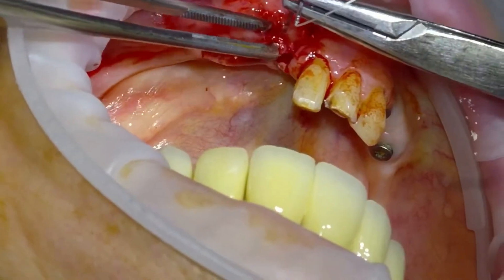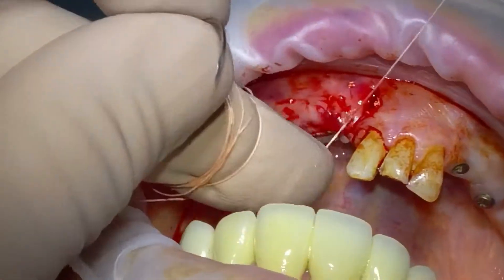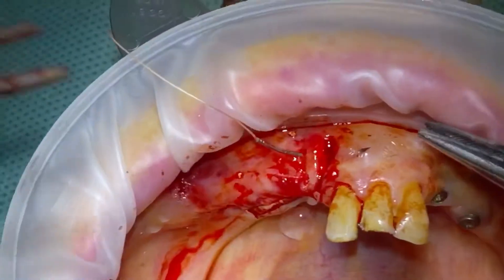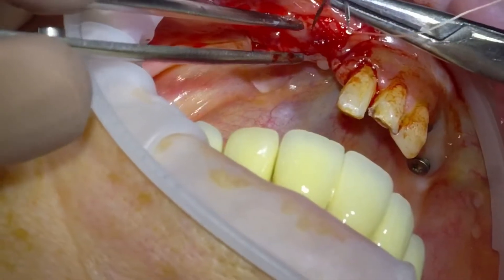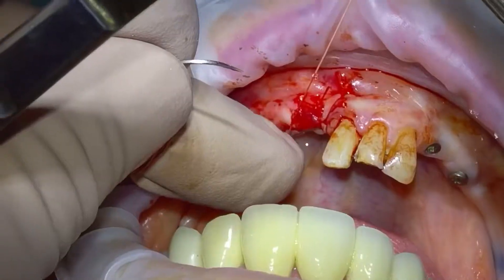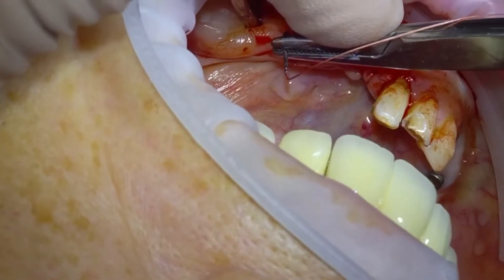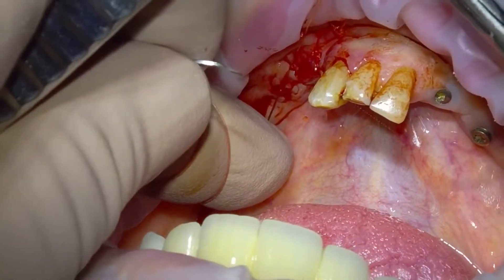Then we can start suturing closed. Here I've used a series of simple interrupted sutures. There's a variety of choices — you can use a mattress suture, either locking or non-locking — but for ease of this case and good approximation I just went for simple interrupted sutures. It's all passive primary closure, so it all approximates together nicely with no tension.